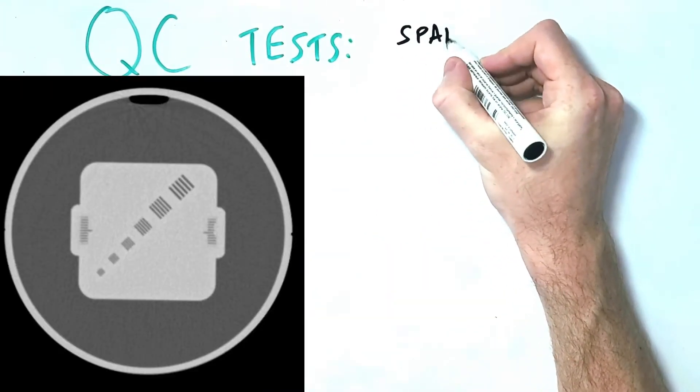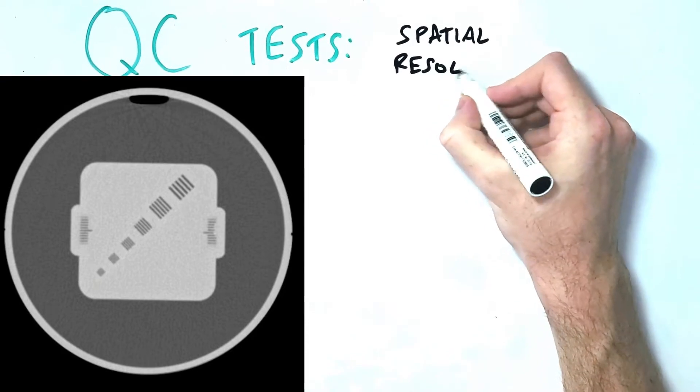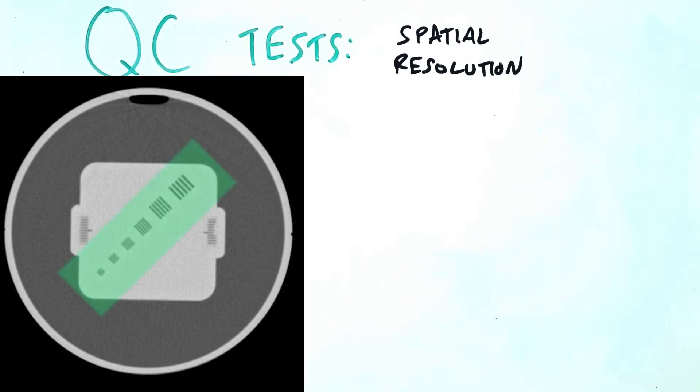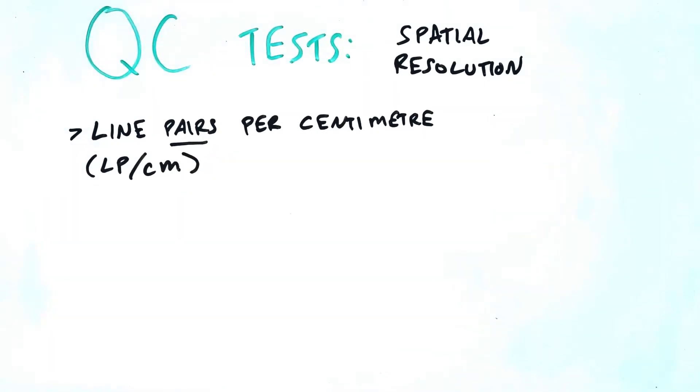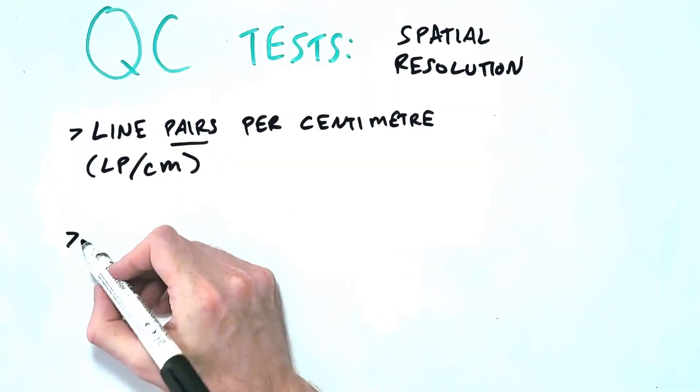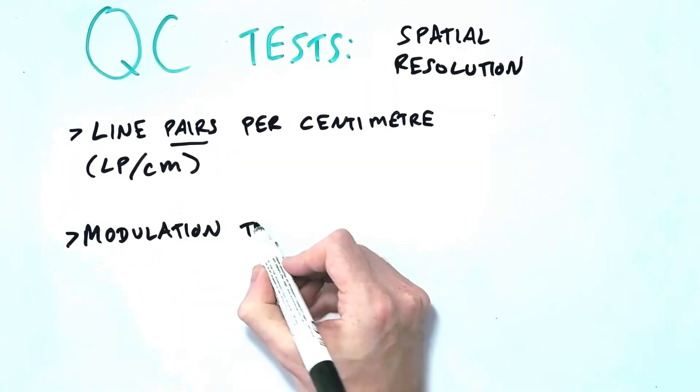Also shown on this phantom, we have the spatial resolution test with these sets of lines in the center which gets closer and closer together. Spatial resolution is the ability to resolve between two different objects which are close together in physical space, like these adjacent light and dark lines. In CT, spatial resolution is described in terms of line pairs per centimeter.